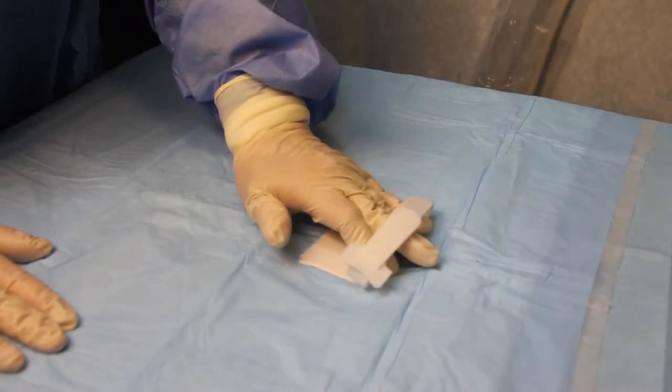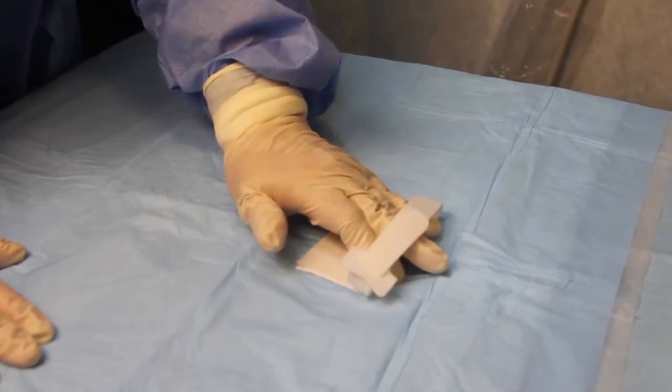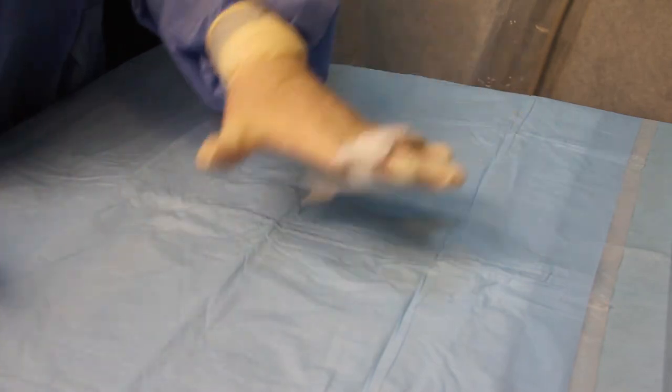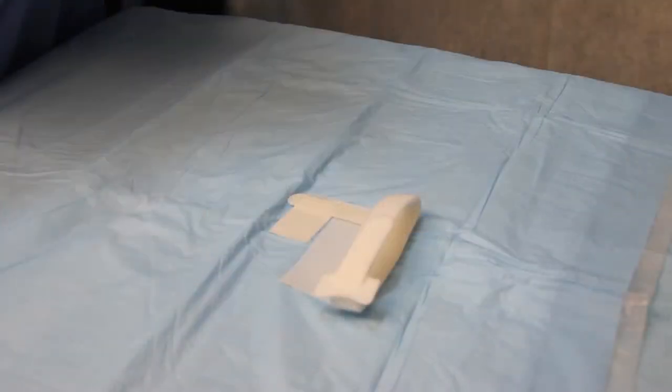Pick up the AnchorSound with your hand through the loop so the Velcro is on your palm. Peel the backing off the large pad only. Place the AnchorSound on the sterile field where you would normally put the ultrasound probe.